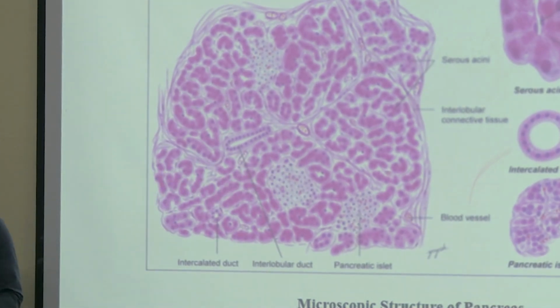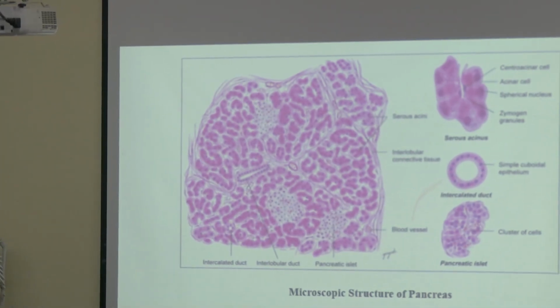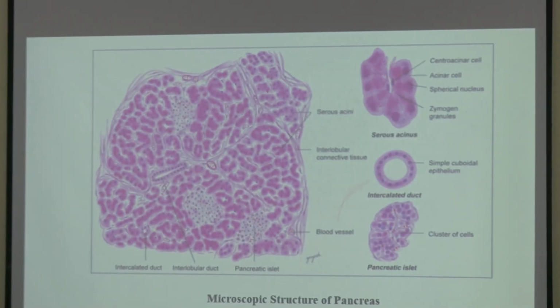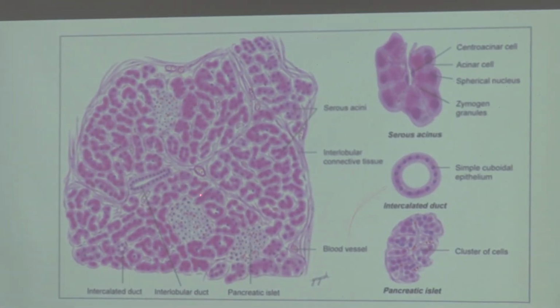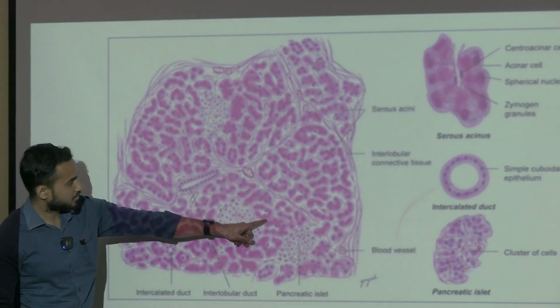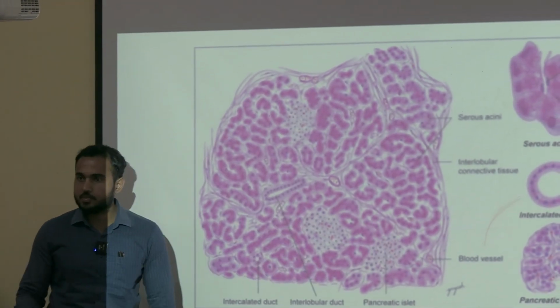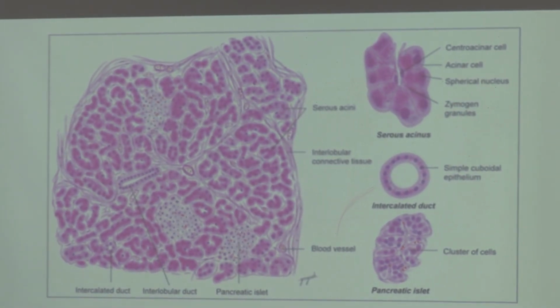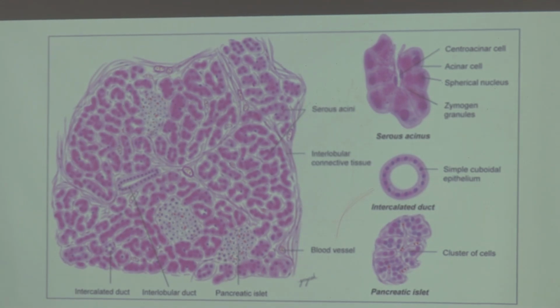What can you see in this lobule? First, you have to see, though we are discussing the exocrine part, that you will be focusing on acini. Can you see the acini? These are nothing but the acini. Now in between the acini, what is this? Islets. No, centroacinar is different; I will show you. So this is the islet. All these are the acini. As I said, the majority is made up of acini, and the pale staining areas that are present are the islets, the endocrine part.